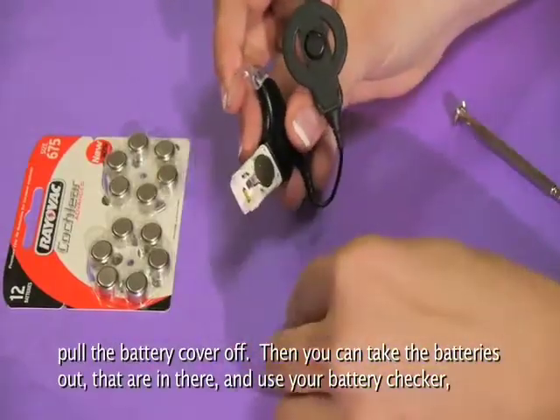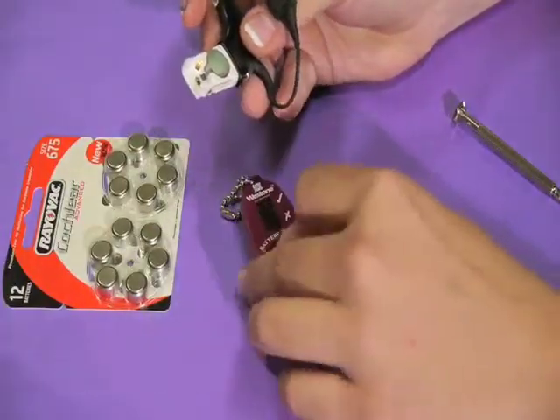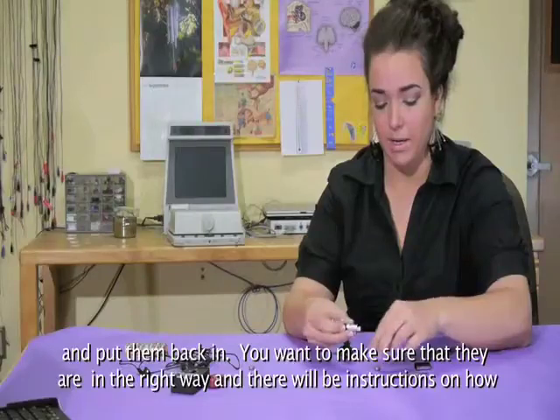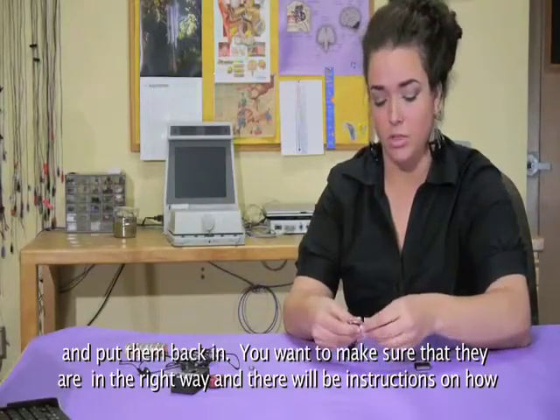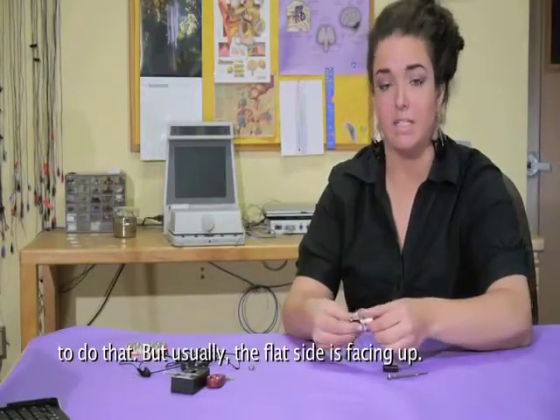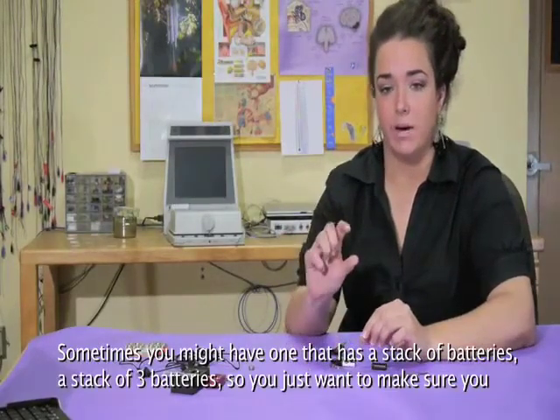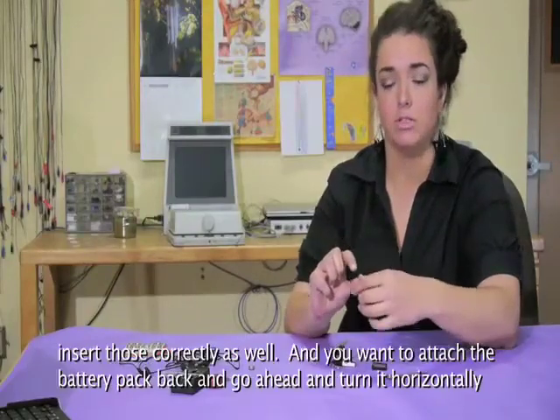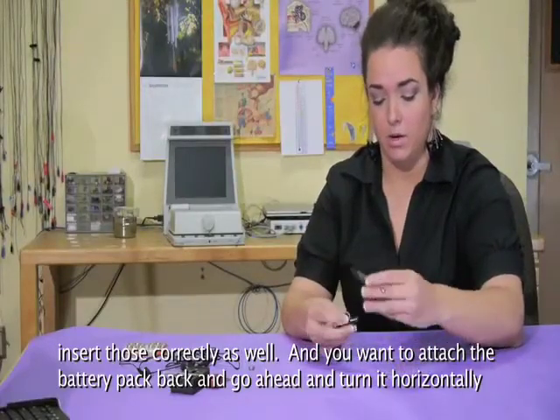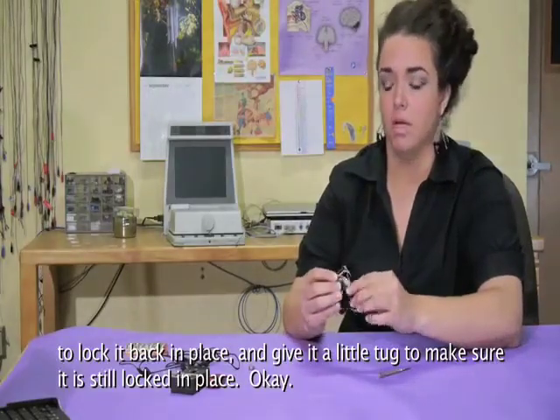You can take the batteries out and use your battery checker, as we discussed in our hearing aid check video. Once you determine that the batteries are good, go ahead and put them back in. Make sure they're in the right way — usually the flat side is facing up. Sometimes you might have a stack of three batteries, so make sure you insert those correctly as well. Attach the battery pack back and turn it horizontally to lock it in place, then give it a little tug to make sure it's locked.